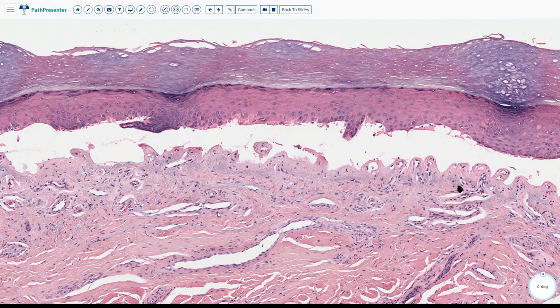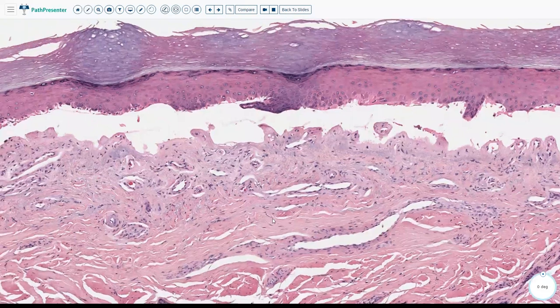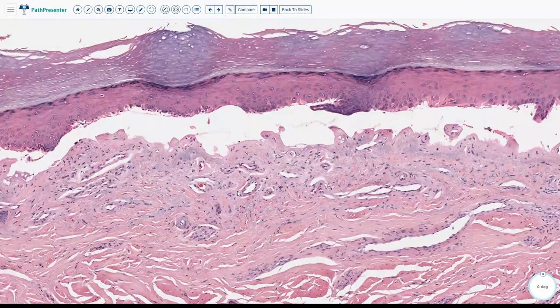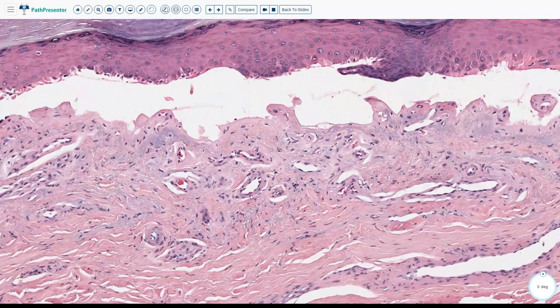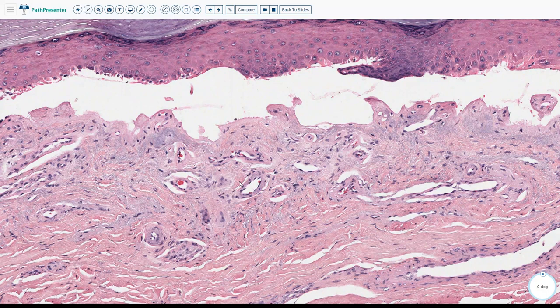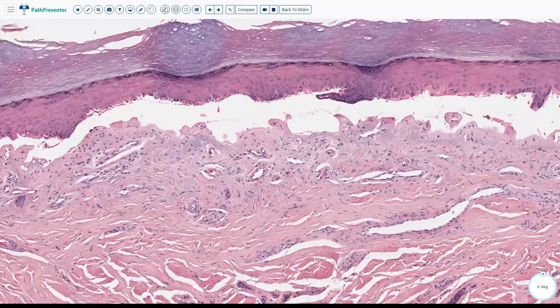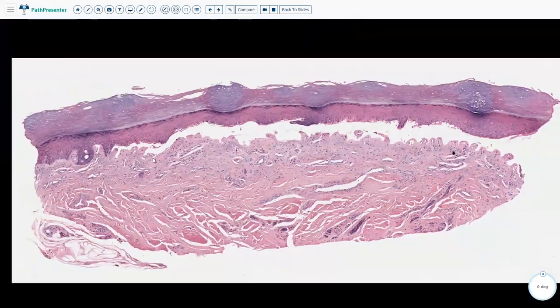At high power, you can see thickening of the vessel wall in the dermis. This is reduplication of the basement membrane seen in PCT, which can be highlighted with PAS — a dark pink area around the blood vessel. Based on these features — caterpillar bodies, festooning, and vessel wall thickening — the diagnosis becomes very easy: this is porphyria cutanea tarda.